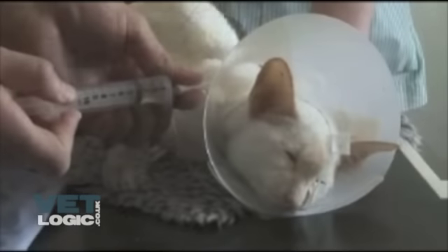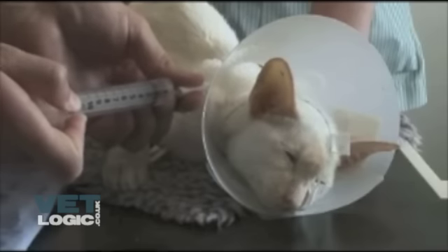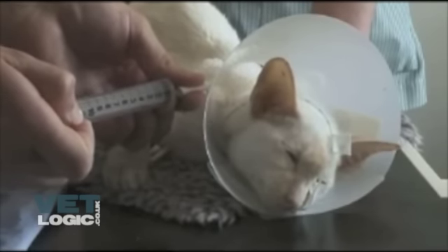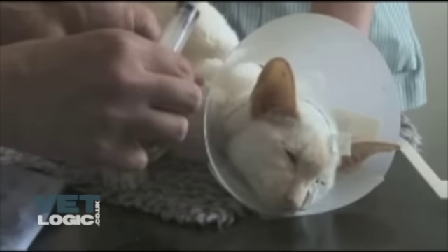Once all the food has been given, the remaining 5ml of sterile water for injection can be flushed down the tube to prevent any blockages occurring. The tube should then be recapped and stuck onto the Elizabethan collar ready for the next feed.